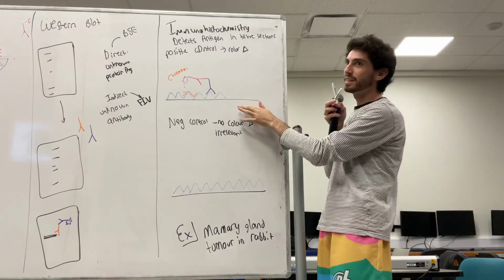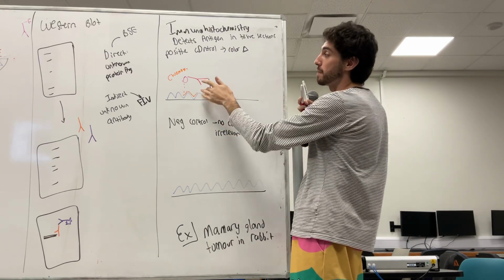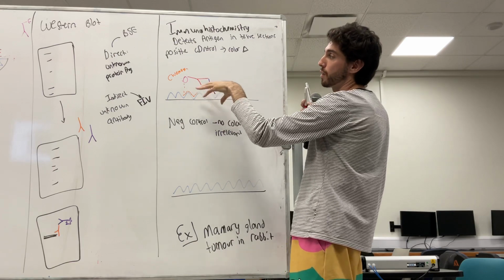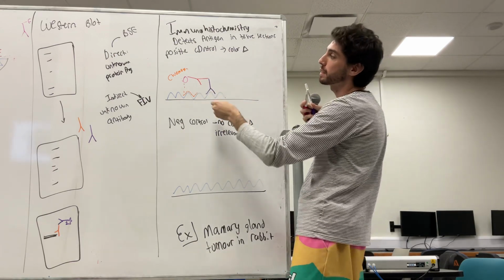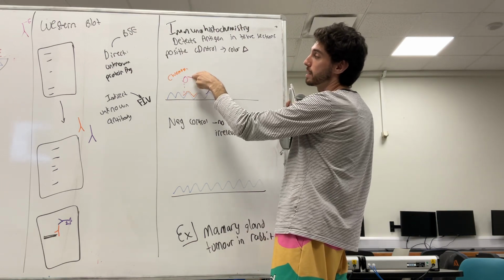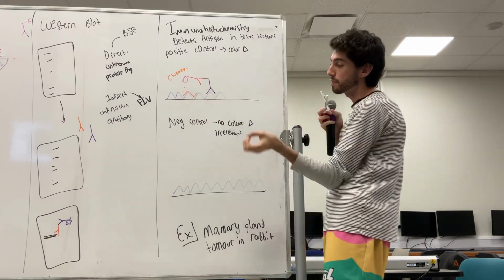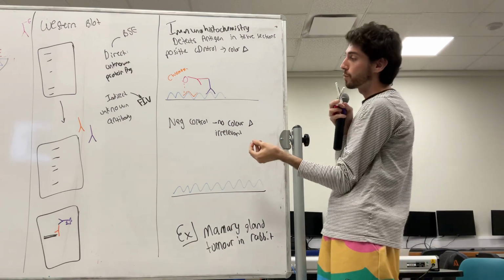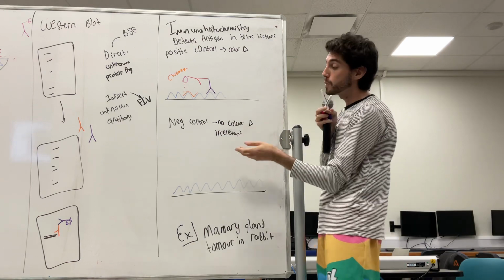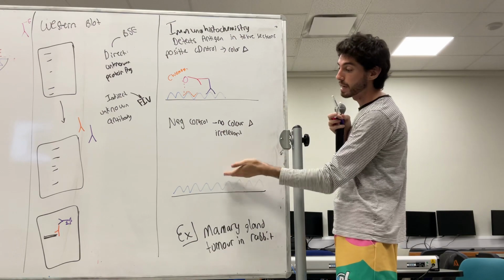You're going to have the tissue section here, which is from our patient, and then we're going to run an antibody over it, and if the antibody can bind, we're then going to use a specific type of fluorochrome, basically called chromogen, and it's going to be converted with an enzyme that's on this anti-antibody. Then if we see brown, we know that it's positive, and if we don't see anything, that's the control where we use an irrelevant antibody. Our antibodies are both going to be known for this. So we use an irrelevant antibody that we know 100% is not going to stick to those antigens, so we're not going to see anything here.